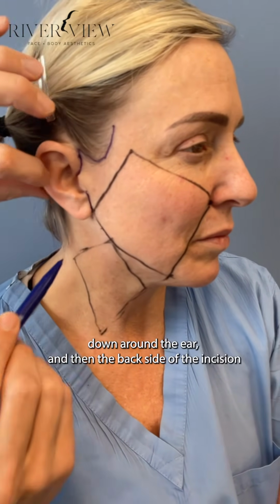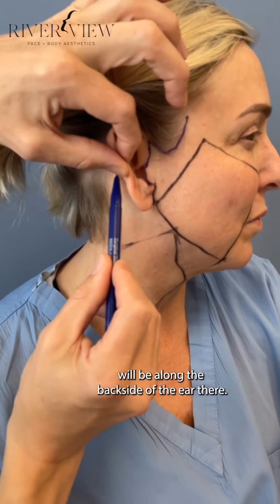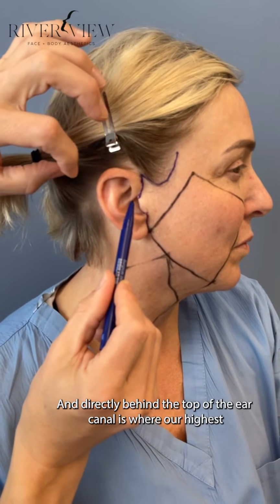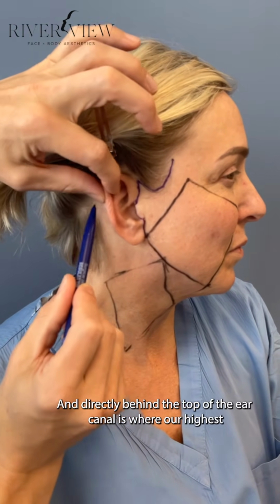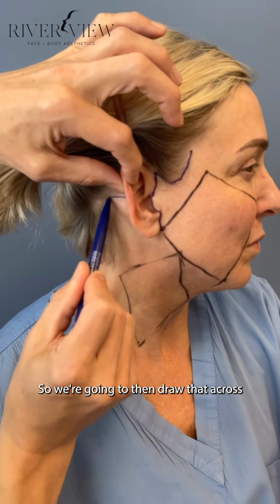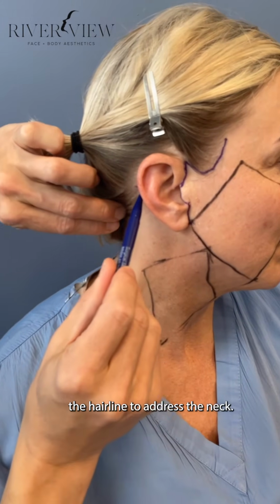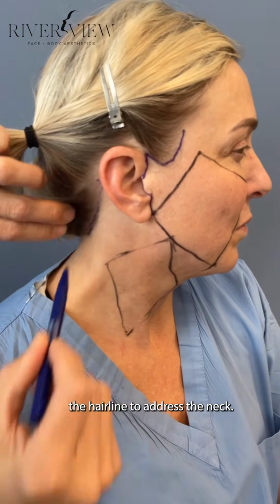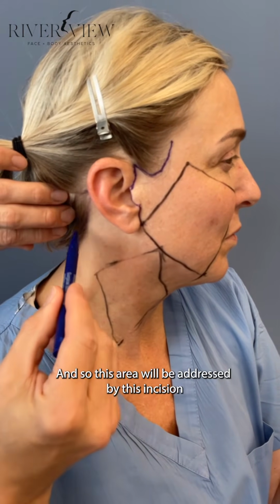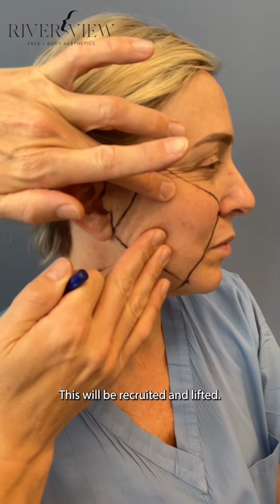down around the ear. And then the back side of the incision will be along the back side of the ear there. And directly behind the top of the ear canal is where our highest point of our incision is going to be. So we're going to then draw that across. And then we're going to go along the hairline to address the neck. And so this area will be addressed by this incision, and the rest of the face as well. This will be recruited and lifted.